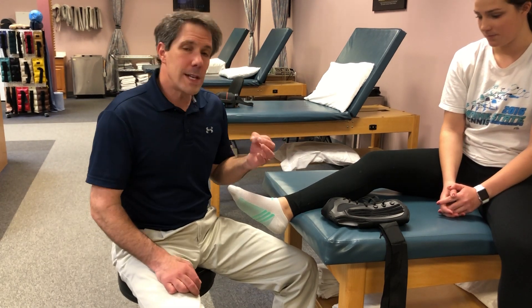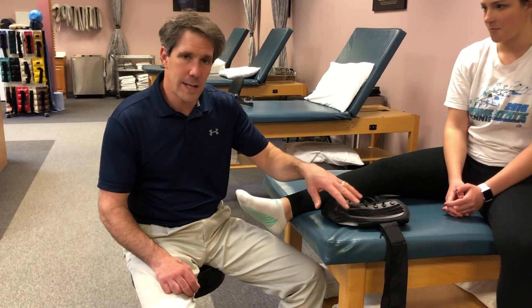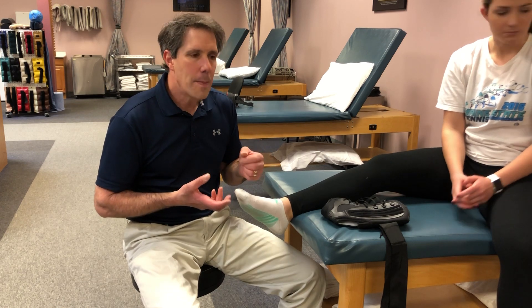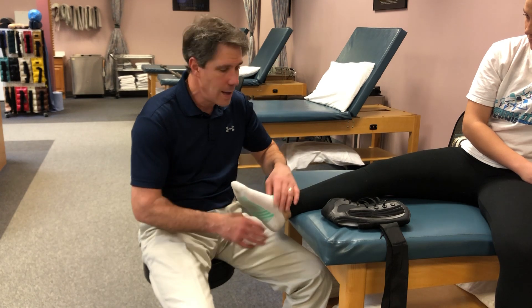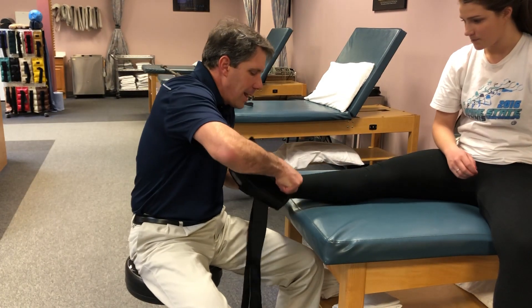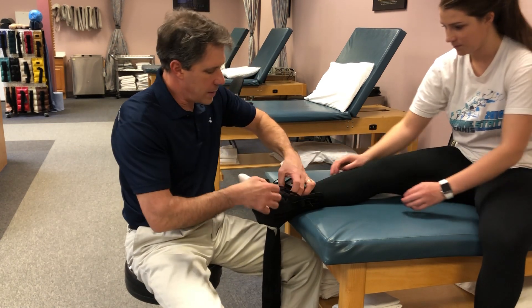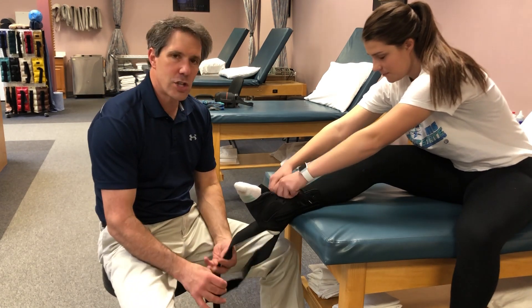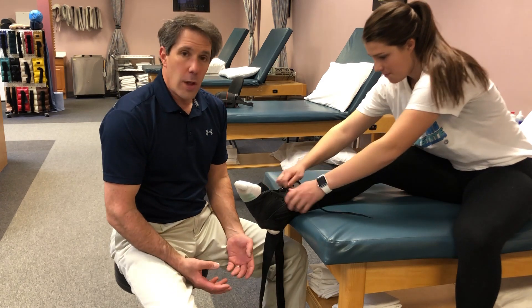One of the things I do with patients with acute posterior tibial tendonitis is put them into a lace-up brace just to give them a rest. Sometimes an orthotic can be okay, but acutely a brace can be a little bit better because it helps prevent the ankle from going side to side. I like to make sure it's a lace-up brace — one that also has these straps — and there's a very good reason for that.